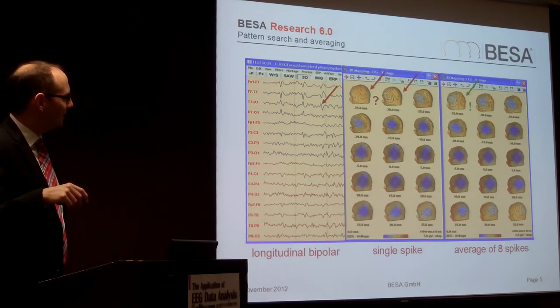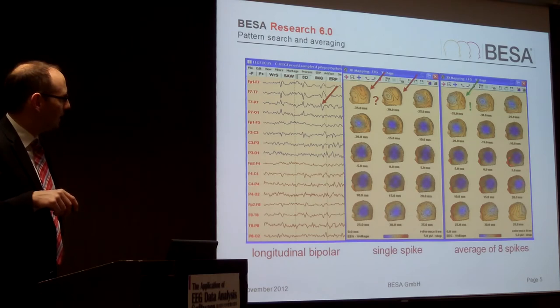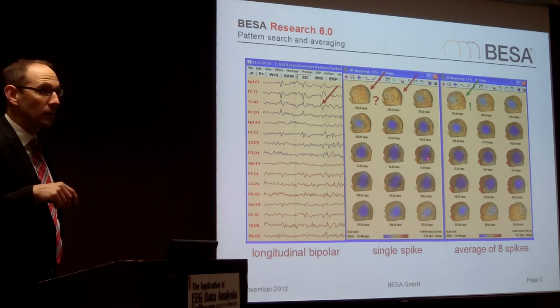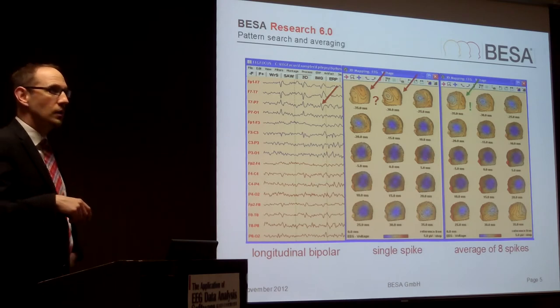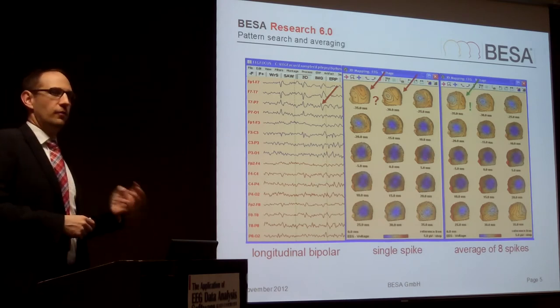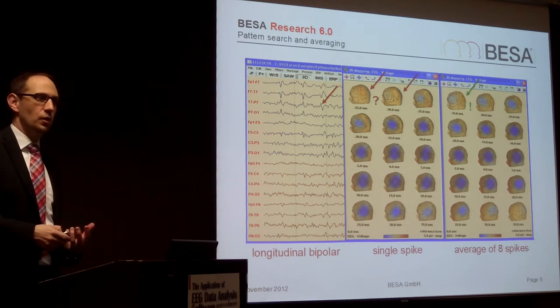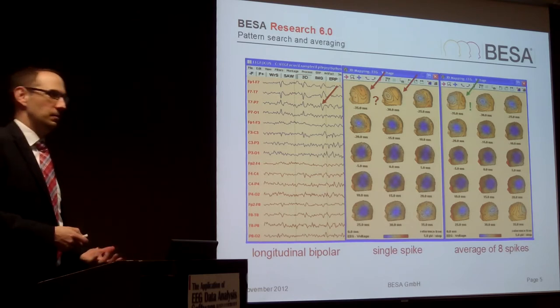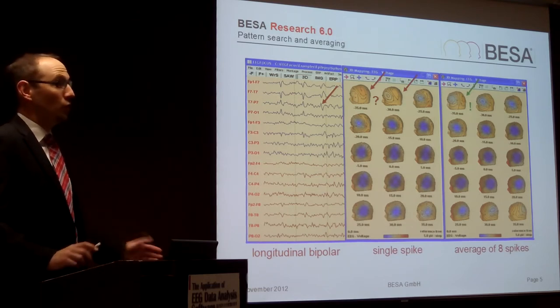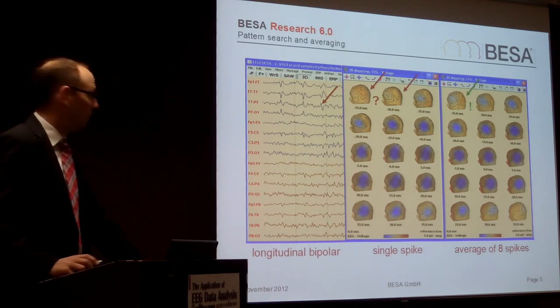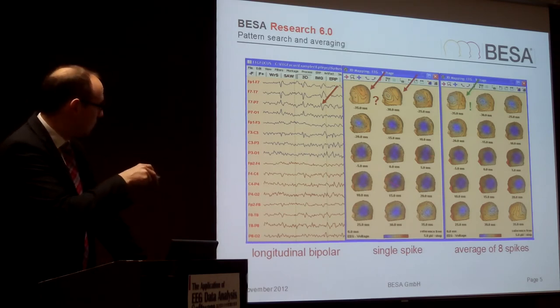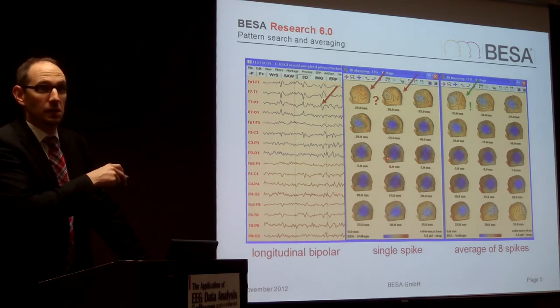If I take an average of eight spikes, you can see the result is getting more robust and more focal — the blue dot is not as big. So you gain precision by averaging. That's a very interesting point, especially when it comes to epilepsy and you want to know where the epilepsy is coming from. In this case we have a temporal lobe epilepsy.